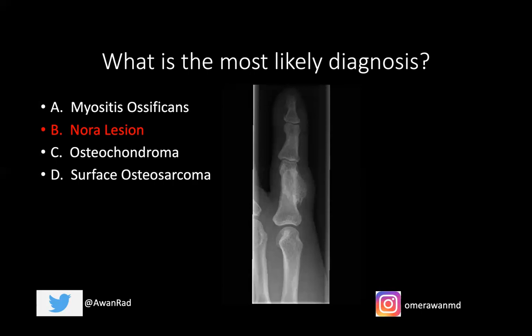A surface osteosarcoma would be very uncommon in the hand — that would be very rare. We also see no aggressive features: no periosteal reaction, no Codman's triangle, no destruction of the underlying bone. So surface osteosarcoma is much less likely.